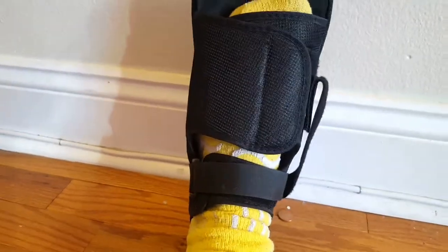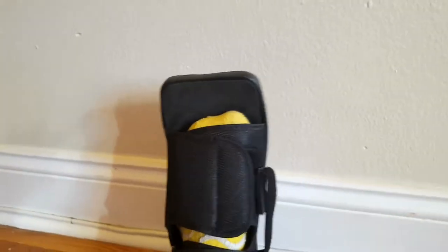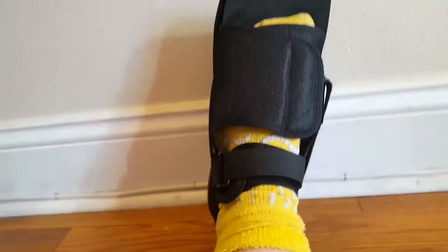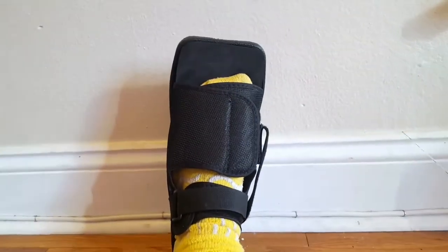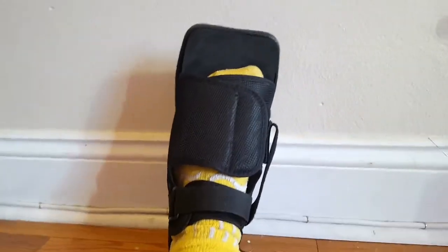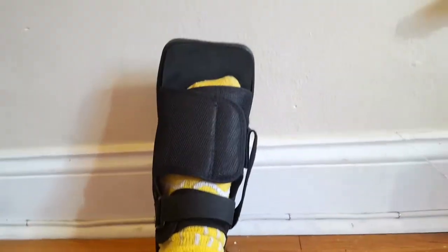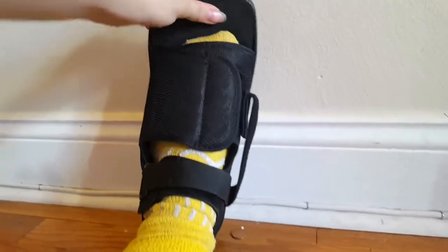It's an open-toed shoe. I know they make some that are closed-toed, but I like this because it just lets my toe breathe. It's not supposed to look good anyway — it's just supposed to help me heal. It does look like a giant sandal that's a little too big, but it's actually just right. This one is a large and I'm a size nine, but I think it can fit up to about an 11, so it can accommodate a variety of different sizes.